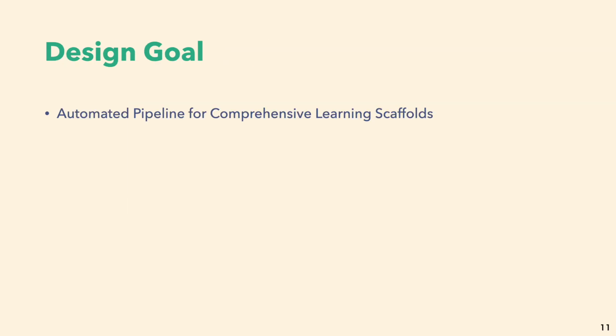Therefore, the design goal of our system is to provide automated learning scaffolds to build troubleshooting, visual motor, and visuospatial skills. First, we introduce sub-goals for troubleshooting tasks, breaking down the learning process into step-by-step adjustments to help trainees systematically refine their probe movements.